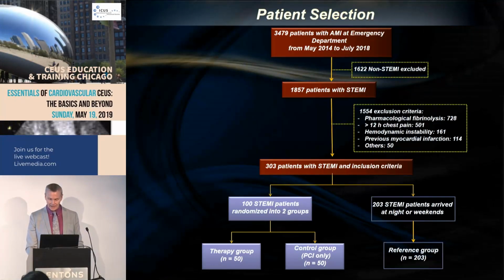And so what we did is we took the patients that came in from 7 a.m. to 7 p.m. because that's when we had a fellow available to apply the high MI impulses, apical 4, apical 2, apical 3, just aiming at the microvasculature here. Nothing about trying to aim at a coronary artery. Just aim it at the microvasculature, because we knew that's where we were getting the beneficial effects. Even upstream, we were getting beneficial effects.